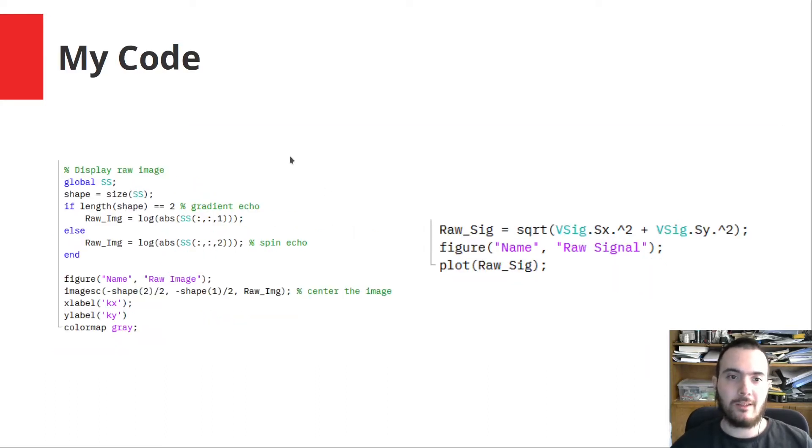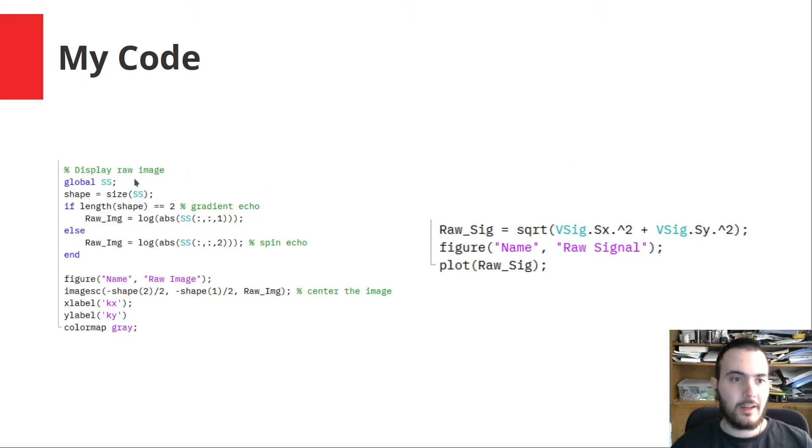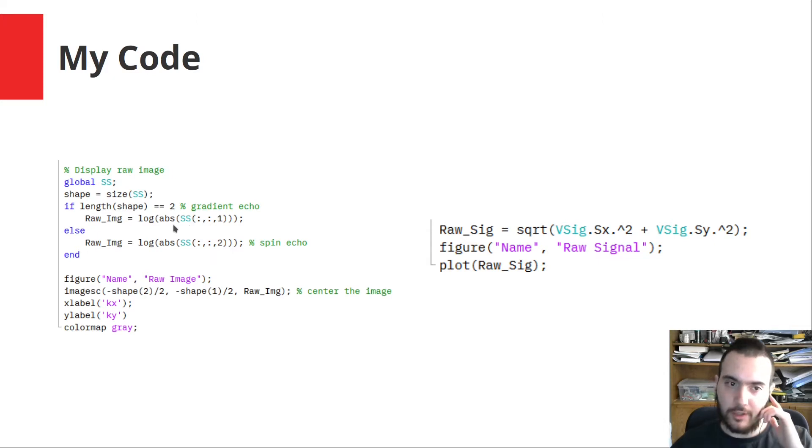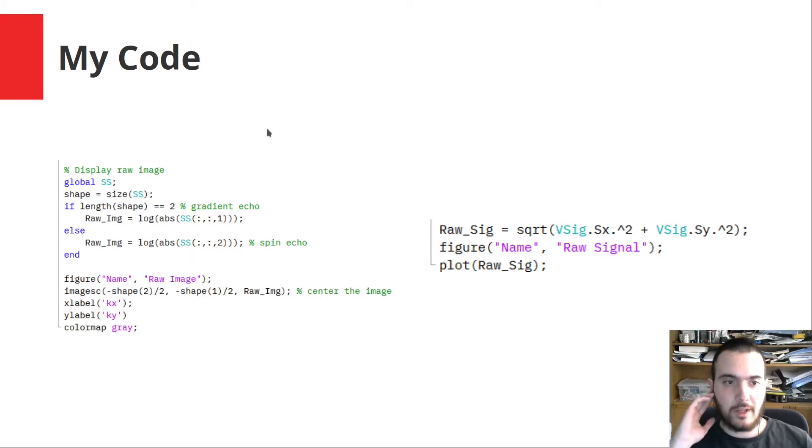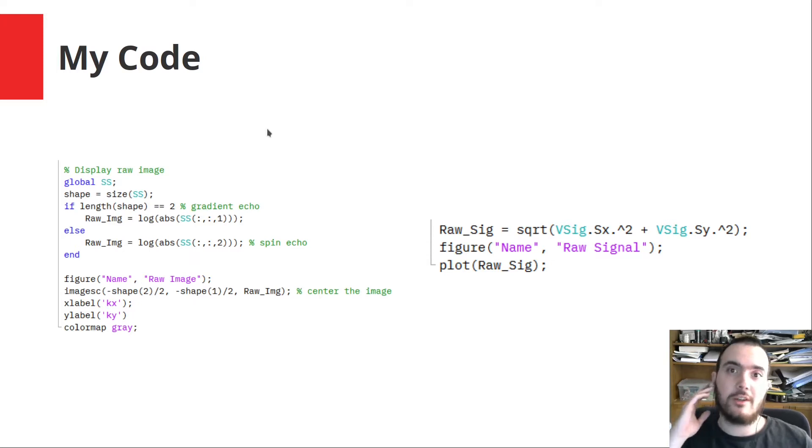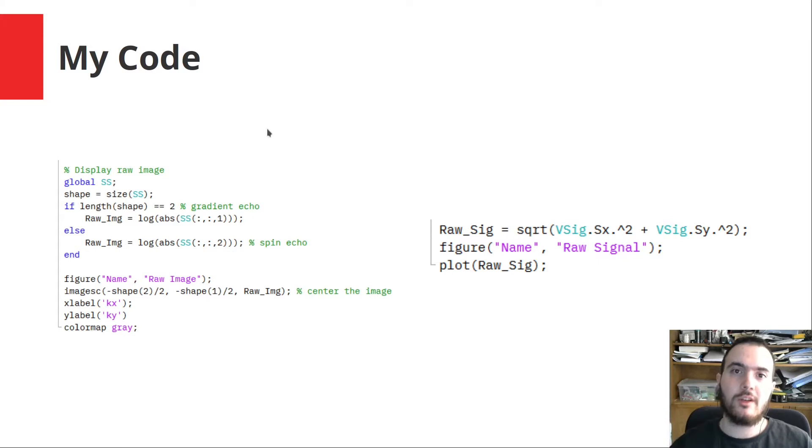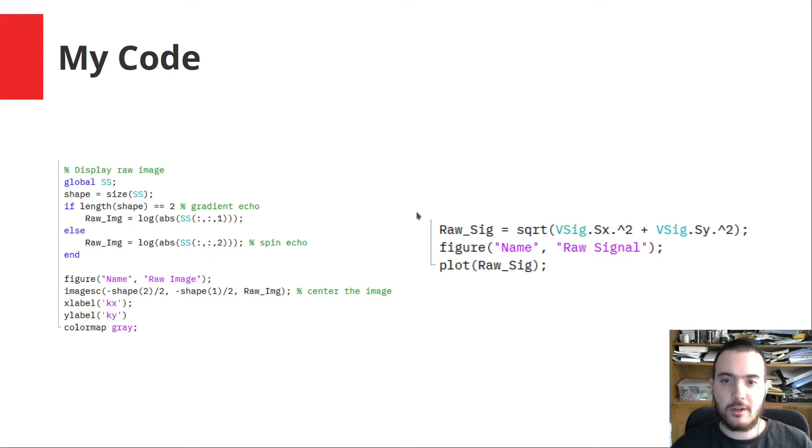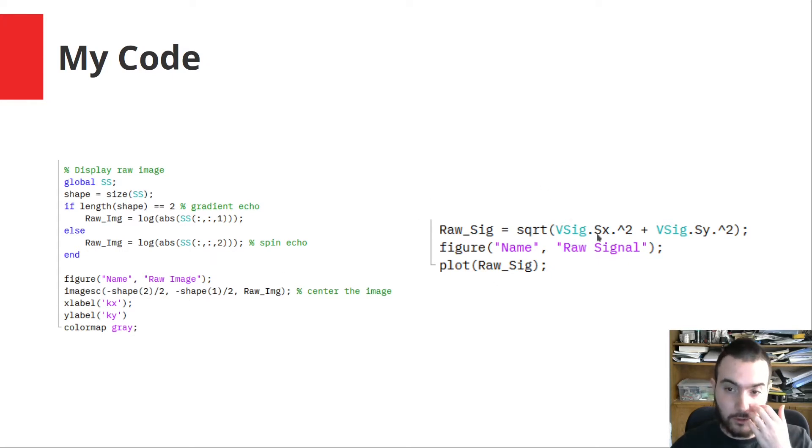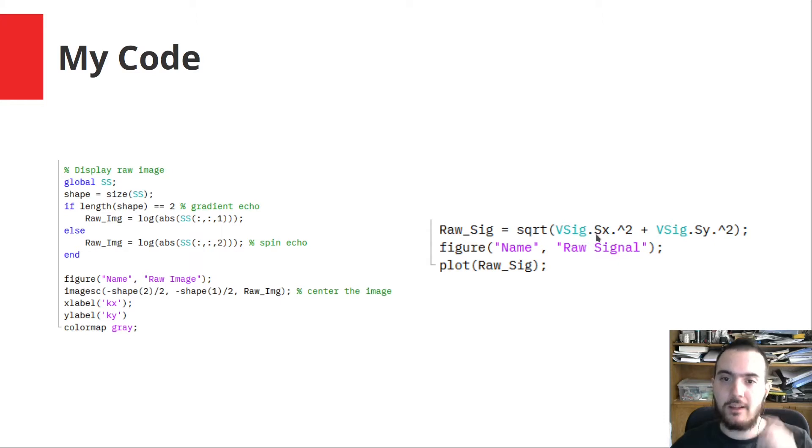What I added was for displaying the raw image and the raw signal. For the raw image, I have taken the absolute value and the logarithm so that it is clearer, because if you do not take the logarithm, then all you see is a bright spot and the nuances are lost. And then displayed this signal in the scaled image. For the raw signal, I just plotted the magnitude of this complex signal in a separate figure.